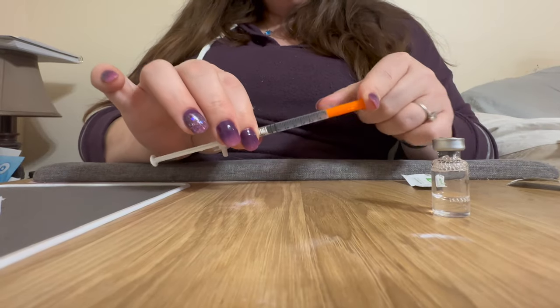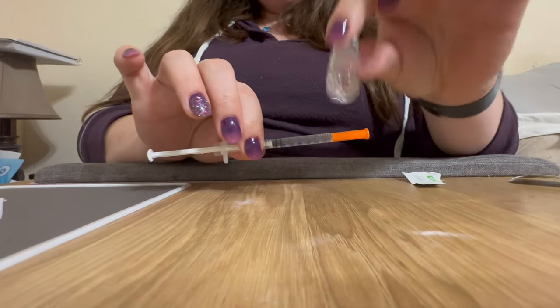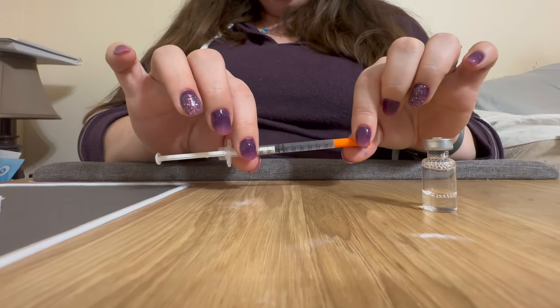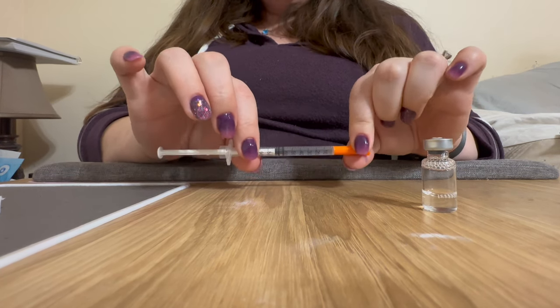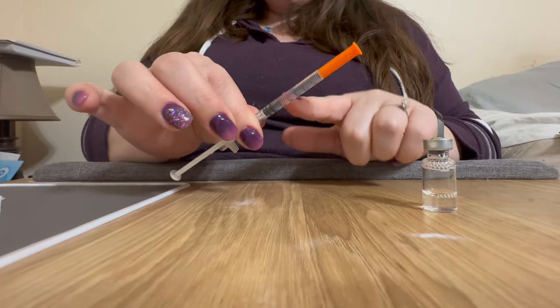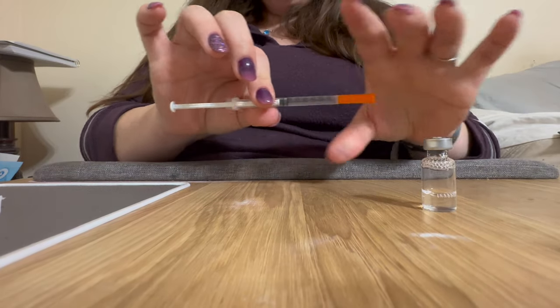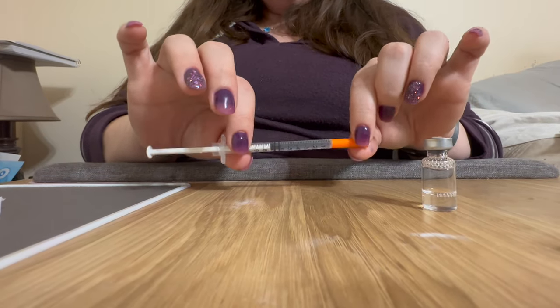I got really sick when I moved from 2.5 to 5 milligrams, so not only is splitting my own doses a way to save a substantial amount of money, it's also a way to titrate up at a more slow and steady pace. Now I have the dose ready to inject. I just took this out of the fridge so I'm going to let it sit out for about a half hour.